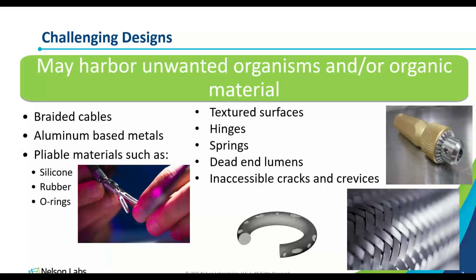But again, there's currently no requirement that you need to do a dry time validation after the cleaning validation or after the cleaning process. But it's still important to have language in your IFU to guide the end users.